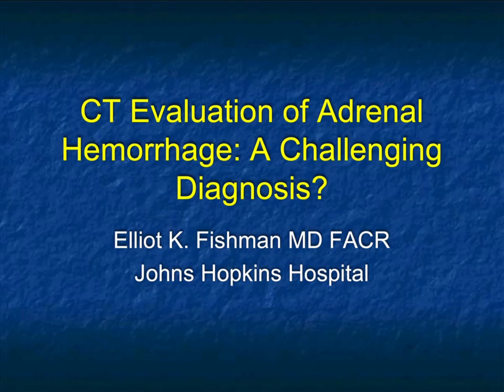We all have this great idea of what an adrenal hemorrhage looks like. Usually it's related to trauma, it's oval, it's high density, or Coumadin, and you have a good clinical history. And those indeed are adrenal hemorrhage cases and are classic, but there are so many other causes of adrenal hemorrhage, and it's not an easy diagnosis. It's often what the pathologist tells us is present, but we did not know it preoperative.